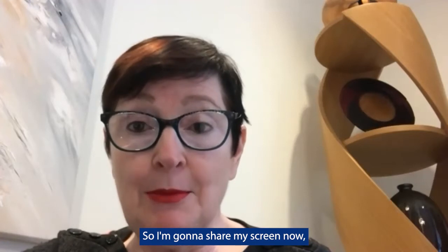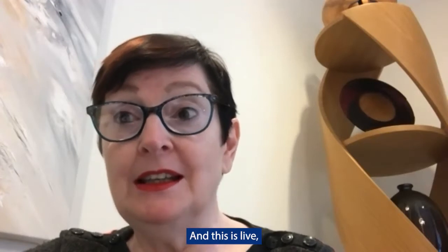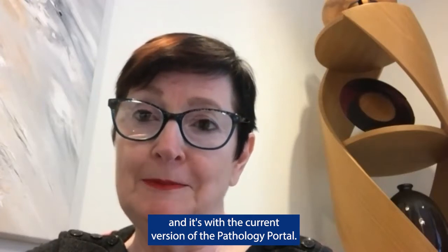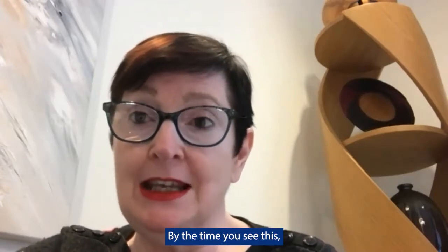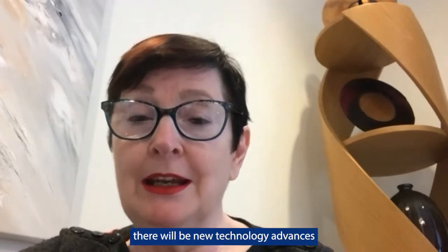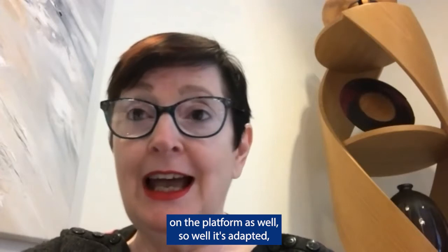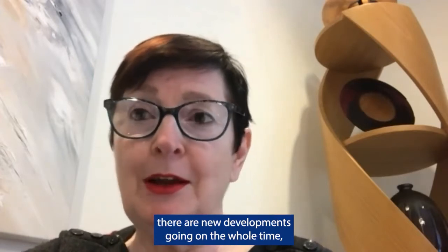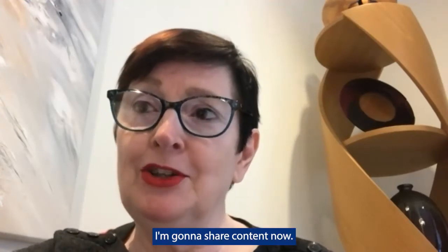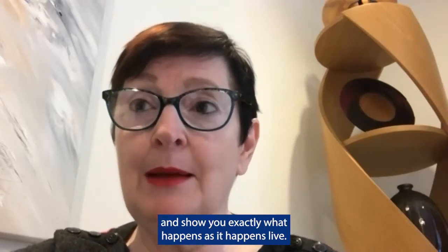I'm going to share my screen now and show you in practice how this will happen. This is live, with the current version of the pathology portal. By the time you see this, there will be new modules up and new technology advances on the platform as well, so it will have adapted. There are new developments going on the whole time, and it's getting better and better. So enjoy. I'm going to share my screen and show you exactly what happens as it happens live.